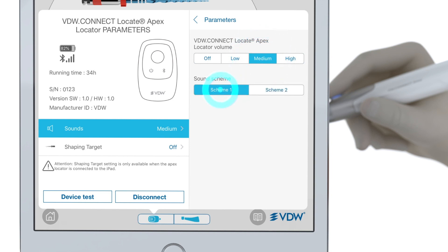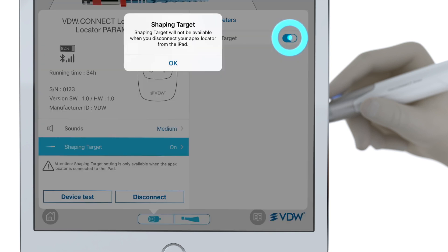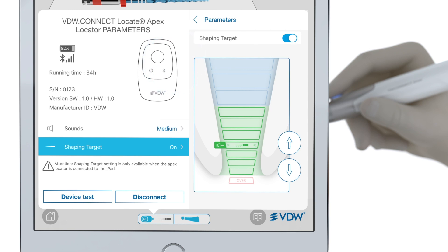In the settings menu, you can find a feature called Shaping Target. When you activate this feature, you can move the reference point — that's the point up to which you want to shape. At the level where you set this point, you'll receive a solid tone and solid green. You can move this shaping target up or down with the arrows on the right or by clicking directly on the bars. It can be set above or beyond the apical constriction, which is the default setting indicated by two little green arrows inside the fourth green bar.